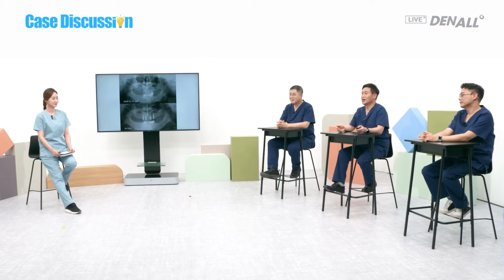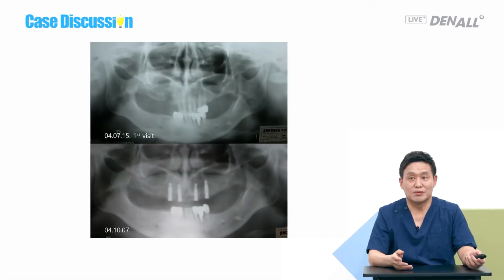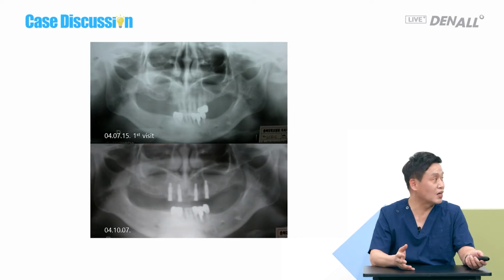Dr. Kim Kyoung-won, I have a similar case. This patient, we didn't have digital panorama at a university hospital that I worked before, so these are the analog pictures. It was like this at the initial visit. We considered implants, but all of them need to be extracted, so we thought about temporary.